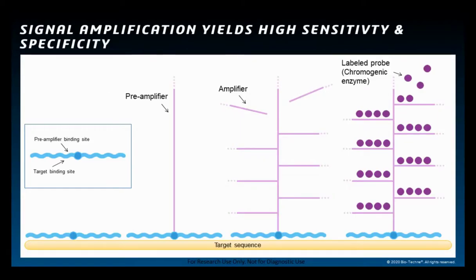As I just mentioned, one of the key features of the miRNAscope assay is the probe design. The oligonucleotide target-specific probes are designed using an informatics algorithm that selects sequences to specifically bind to the target sequence and not cross-hybridize with any other sequences. The bottom of the probe design complements and hybridizes to the target transcripts, whereas the top of the probe is the base for the amplification structure, upon which a pre-amplifier can bind and the amplification tree can then be built.